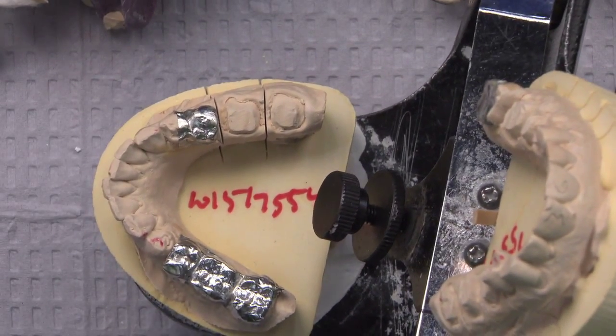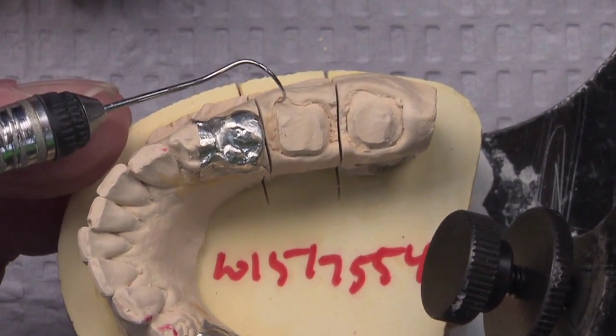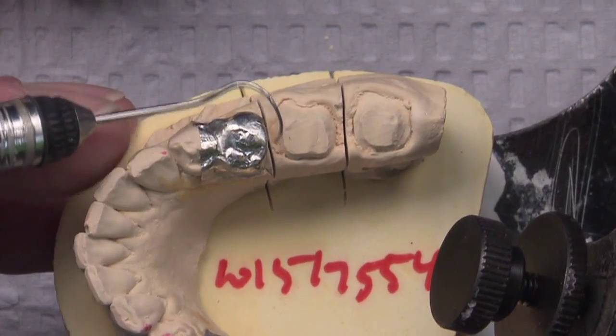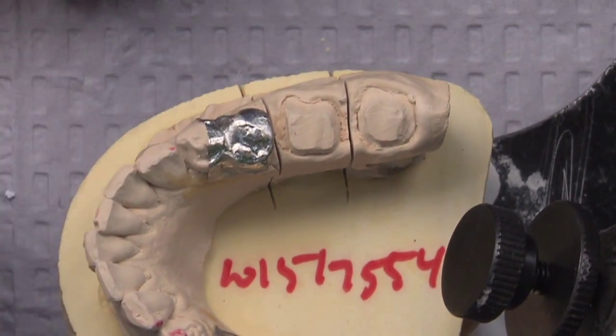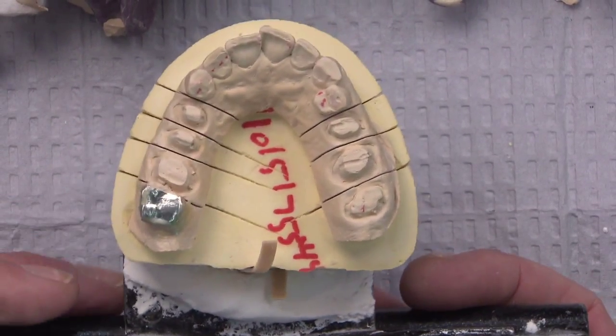And then we look here as well, and again, you can see some separation in a spot or two where maybe there was cord, but you can see there what looks to be tissue that's been coagulated with an astringent. So we can kind of see the margin most of the way around on those two teeth, and then it gets a little sketchier here on some of these preparations on the upper teeth as well.